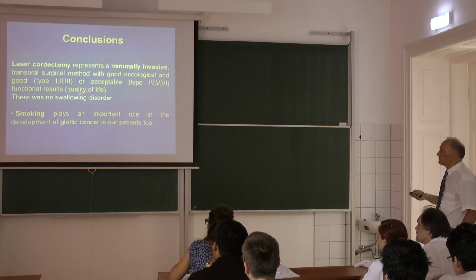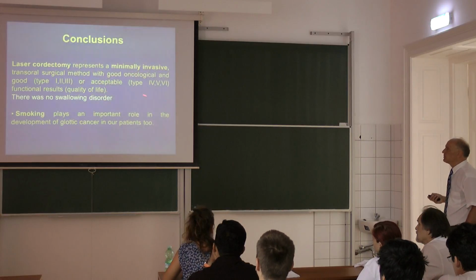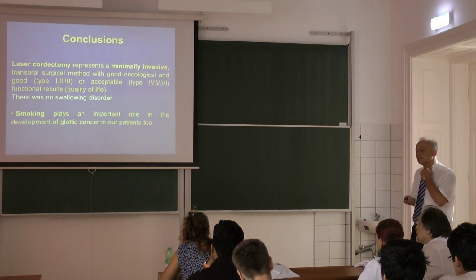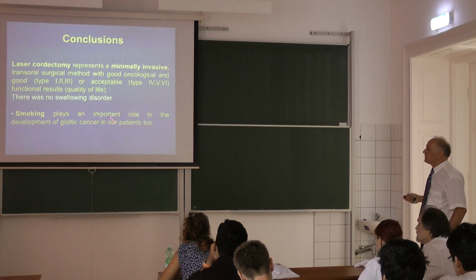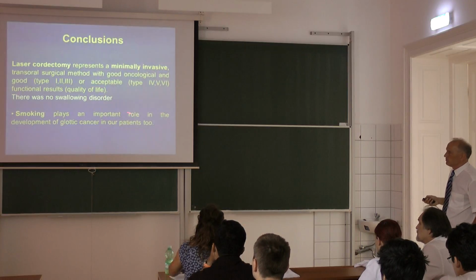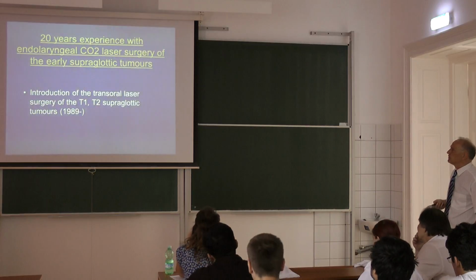So the laser cordectomy represents a minimally invasive transoral surgical method with good oncological results and acceptable functional results as well. And there's no swallowing disorder, no tracheostoma, and we show that smoking plays an important role in this.